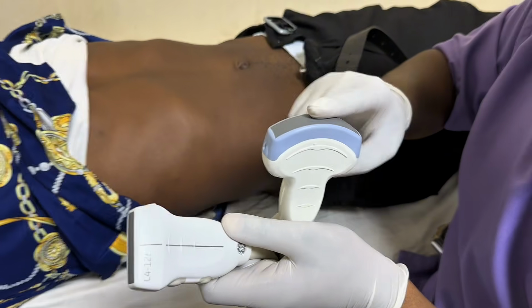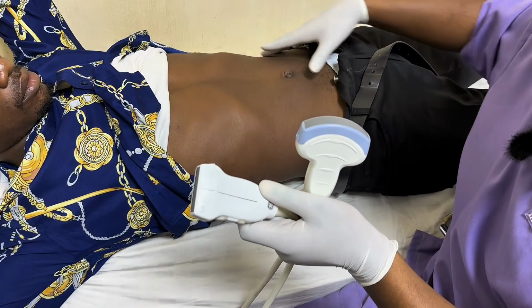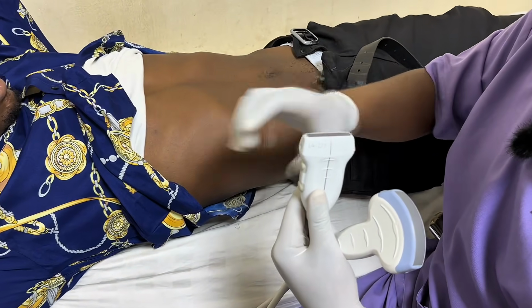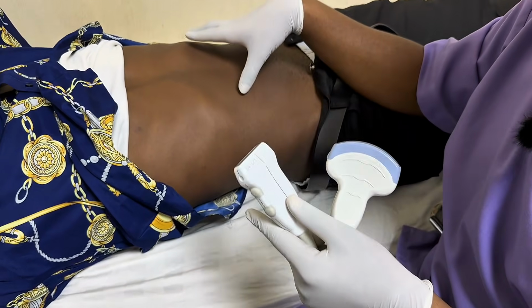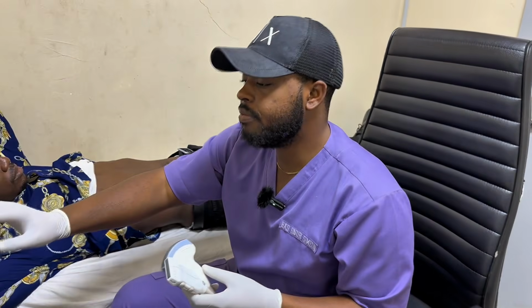I'll be using the curvilinear probe at first just to get a general overview of how the bowel loops are looking. Then I'll use my linear probe to get a good assessment of the bowel loops. So right now, we're going to start the examination. I'm going to show you guys how I follow through on this examination.